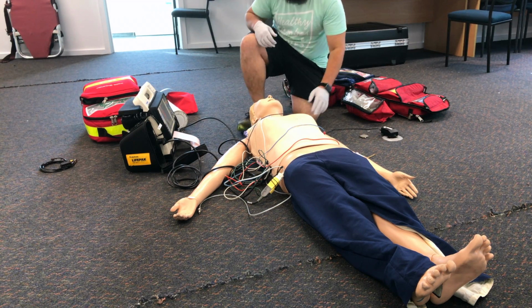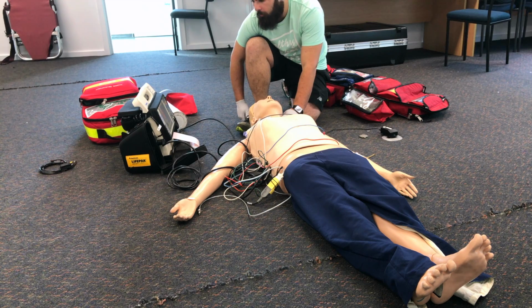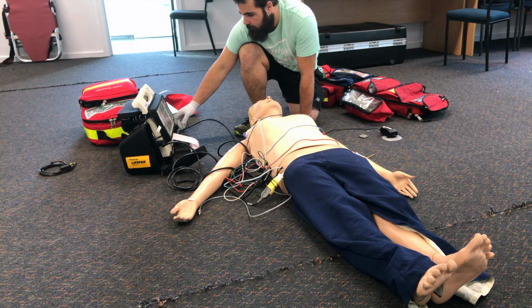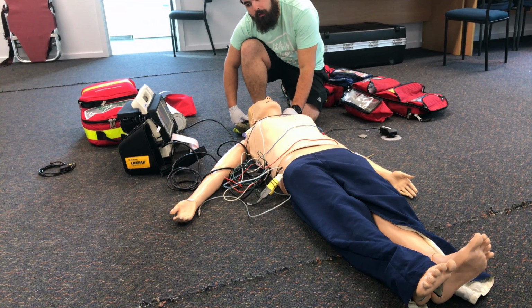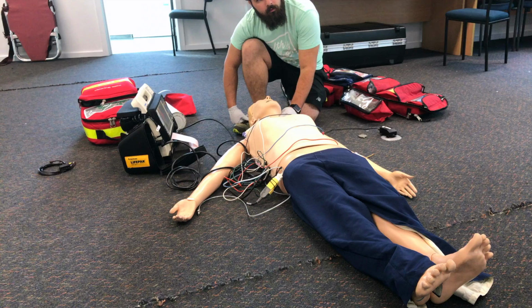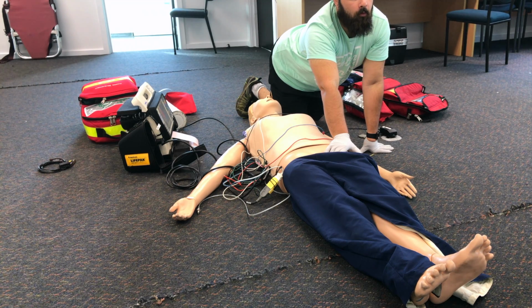I'm going to confirm mechanical capture. I still don't have a carotid pulse, so I'm going to increase the rate until I do. So we're up to 100 beats per minute, and I can now confirm a carotid pulse. And I can confirm a femoral pulse.